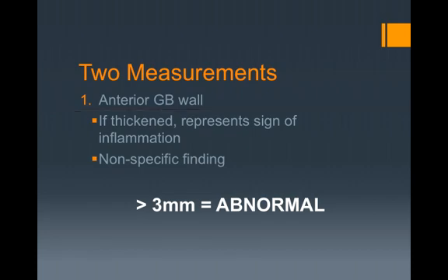Moreover, be certain to evaluate the anterior wall due to acoustic enhancement of the posterior wall, a topic covered previously in ultrasound fundamentals. Briefly, when sound waves travel through a fluid-filled structure, such as the gallbladder lumen, no signal attenuation occurs. Consequently, when those waves encounter the posterior wall, they will be so strong such as to obscure an accurate picture of posterior wall thickness.